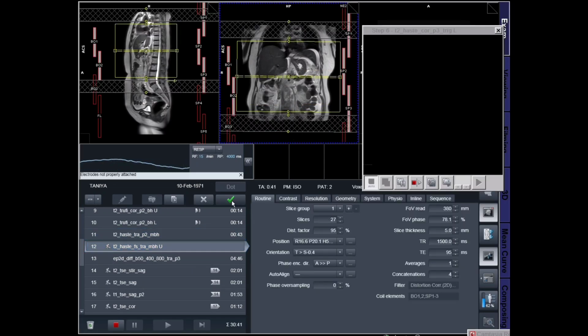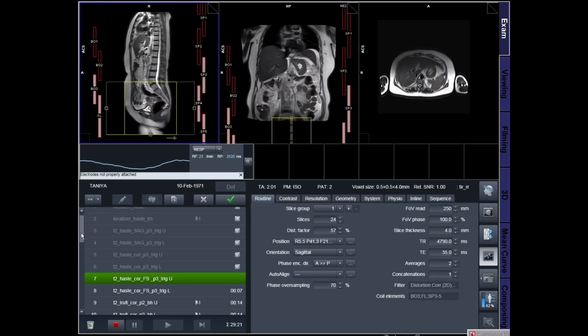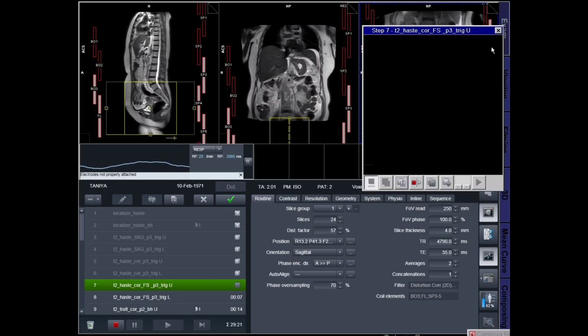Contrast study. In selected cases, gadolinium-based contrast agents are administered. Contrast imaging helps evaluate tumor vascularity, metastasis, and liver lesion characterization.